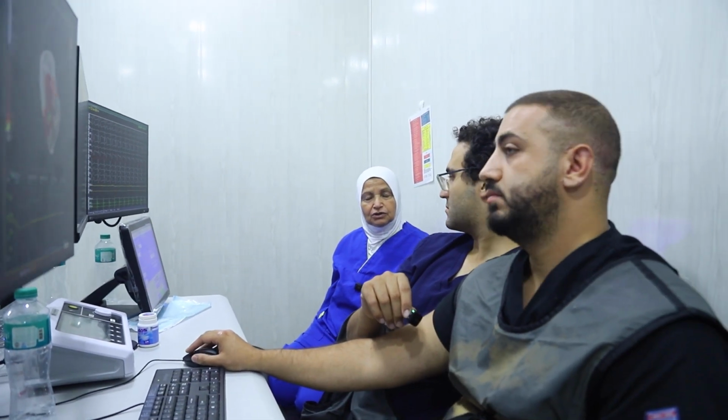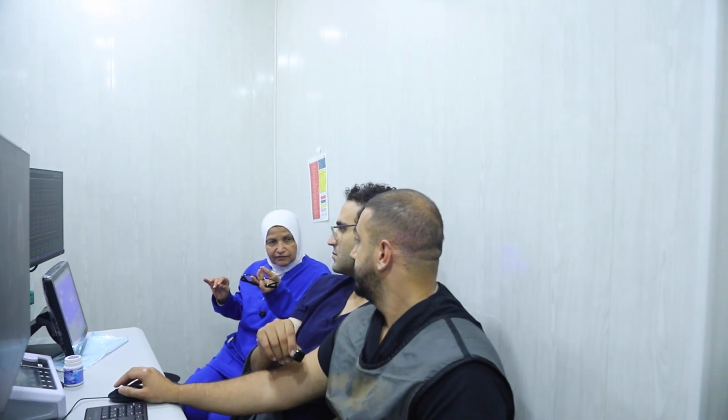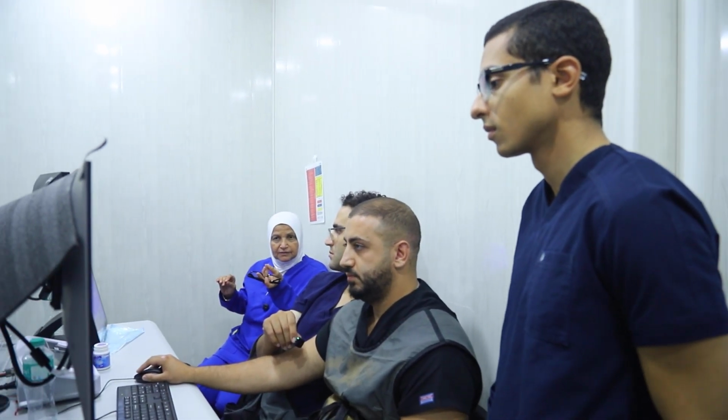So that was a successful case of a PVC which had its origin from the right coronary cusp and was suppressed mainly from the right ventricular outflow tract posterior septum, and we ablated it. Thank you very much, Wael. Thank you for the technology of Abbott with the Insight X. Thank you. Shukran.